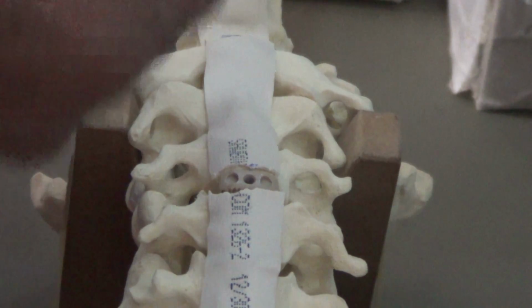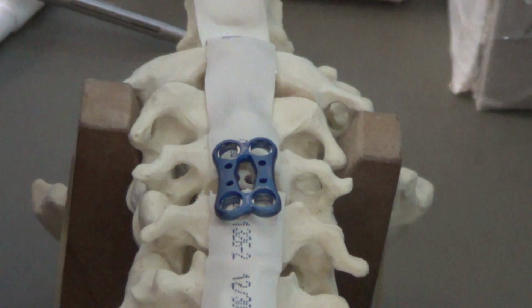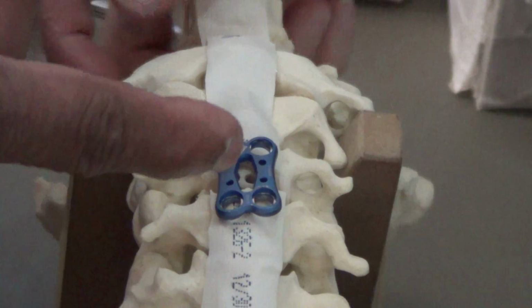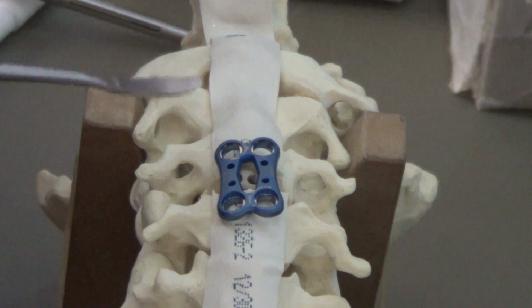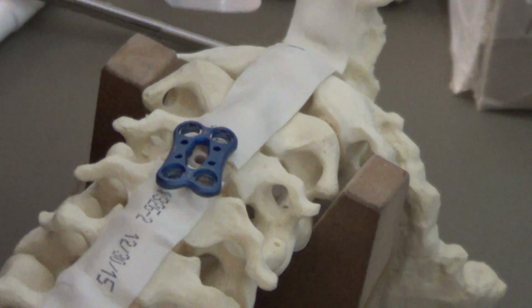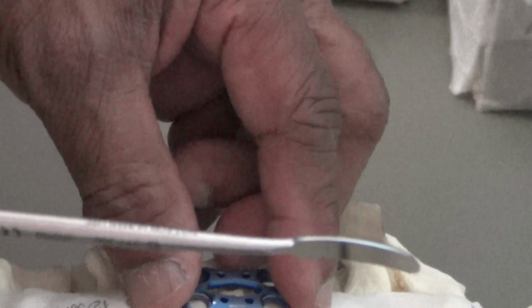So you see, this is a plate. You put a plate in such a way that it spans the disc, and then you must be careful that your size of the plate is adequate. It's not too long, not too short, and it's ideal that your plate doesn't go to about 5 millimeters towards the adjacent disc.